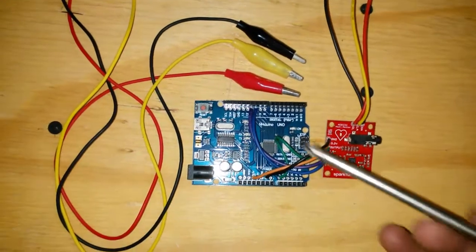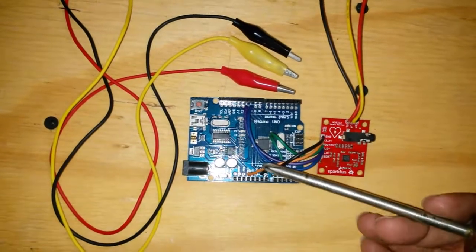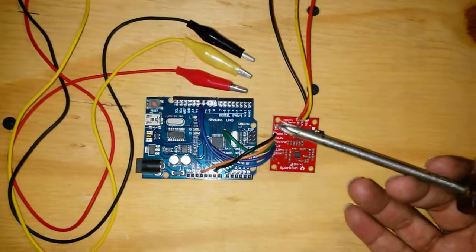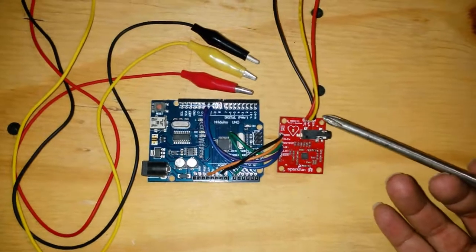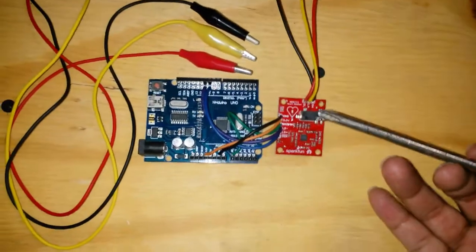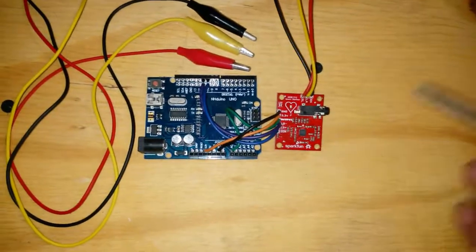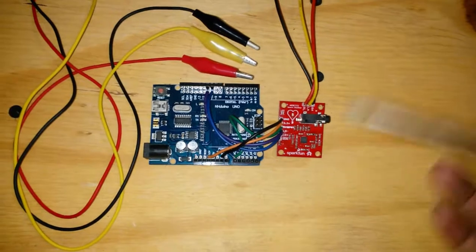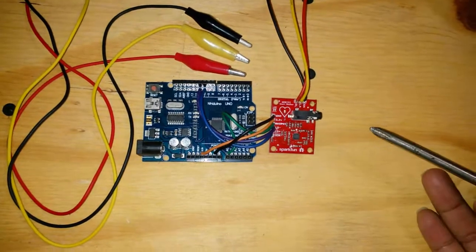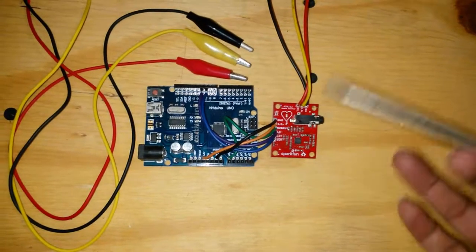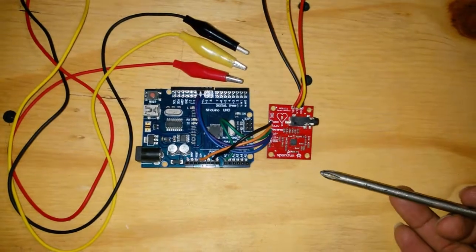And basically, simple Arduino program, simple sketch, and use the processing program. And it works really well. So I was just taking a clip of someone's ECG.